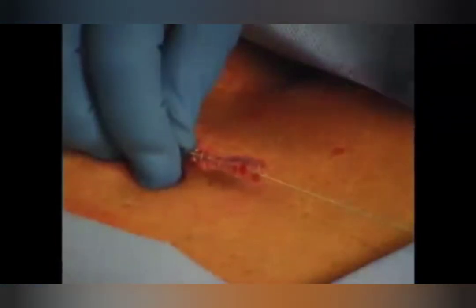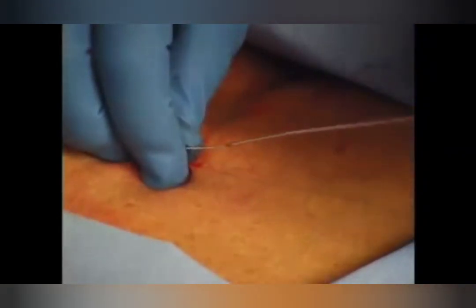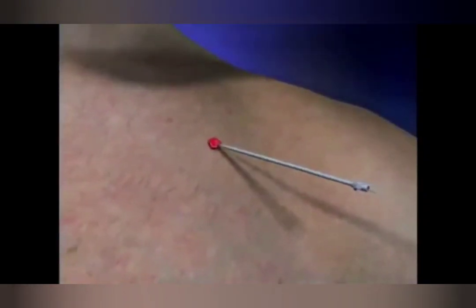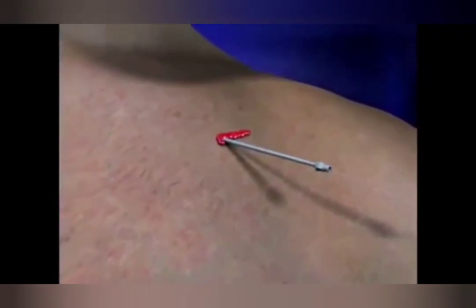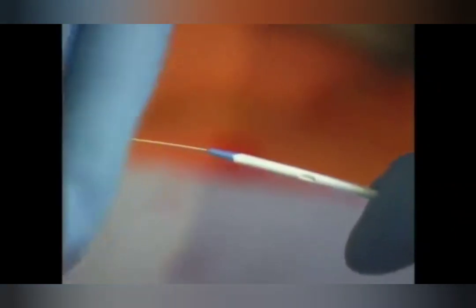Once the guide wire has been advanced almost completely, the needle is carefully removed. A number 11 scalpel is then used to make a stab incision in the skin immediately adjacent to the wire. The dilator is then used to dilate the track where the catheter will be placed. There will be increased bleeding after dilating, so gentle pressure at the insertion site is often helpful but not required. The catheter is then threaded over the wire into the vein.